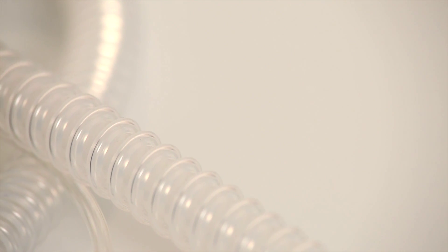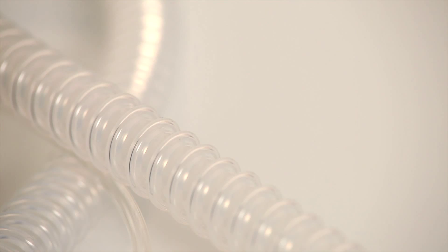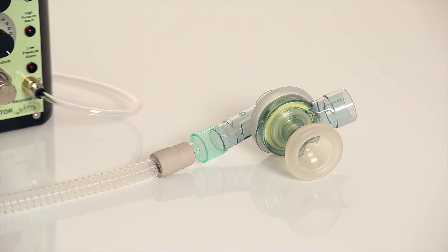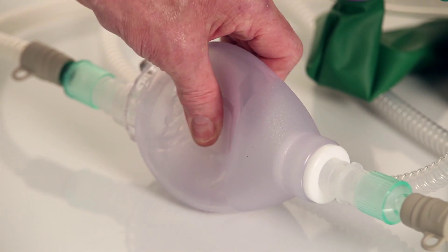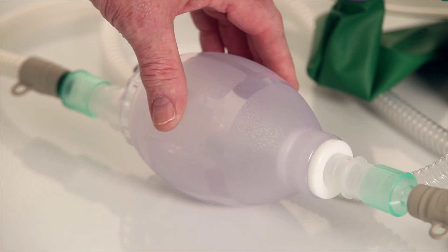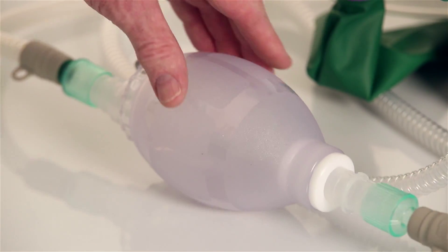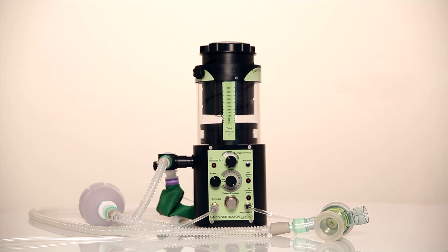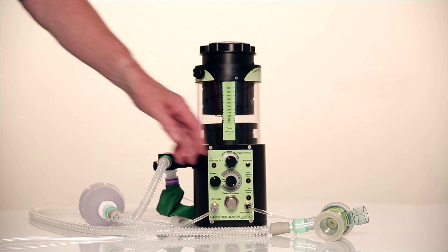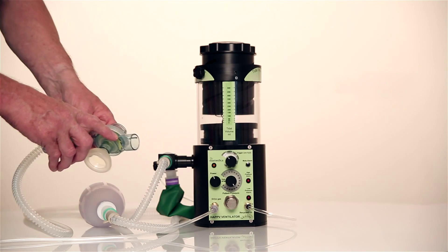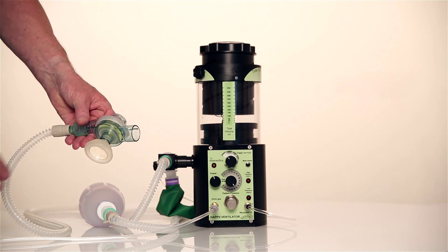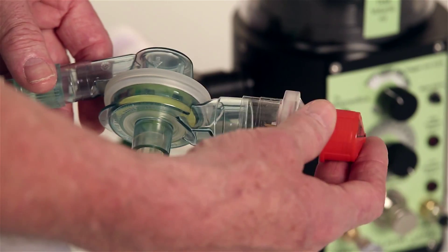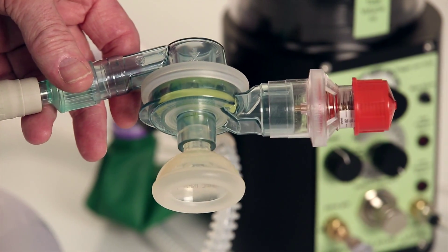The circuit provided is autoclavable silicon tubing with a patient valve at the distal end and a self-inflating bag in the middle to allow manual or assisted ventilation. Expired gases leave the system through the 30mm port on the patient valve and PEEP or scavenging can be applied at this point.